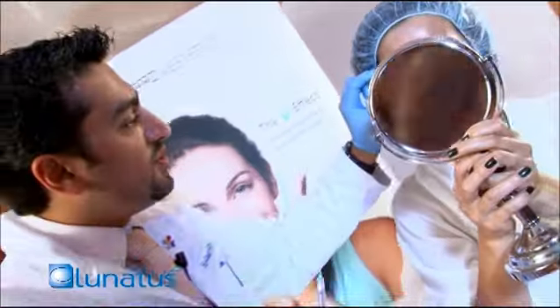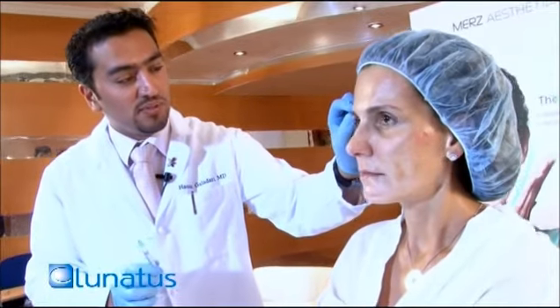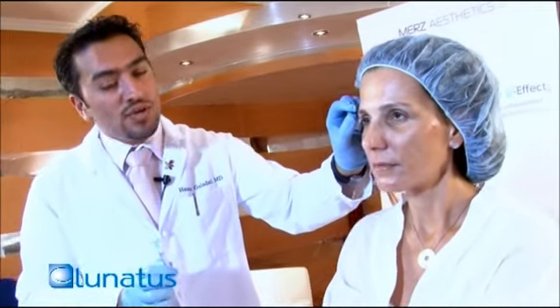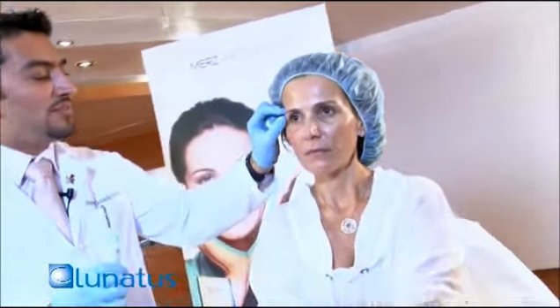And it can raise up the eyebrow itself, and she can see that. The temple is the area that you can inject with calcium hydroxylapatite. The areas that you have to avoid: you do not want to inject the superior orbital rim. You do not want to inject right underneath the eyebrow itself. You can definitely inject that with hyaluronic acid, but not with calcium hydroxylapatite — it can harden up once it's done. You need something much softer than calcium hydroxylapatite, but you can get much better results by injecting the temples.